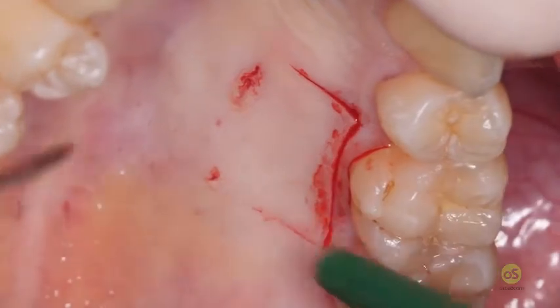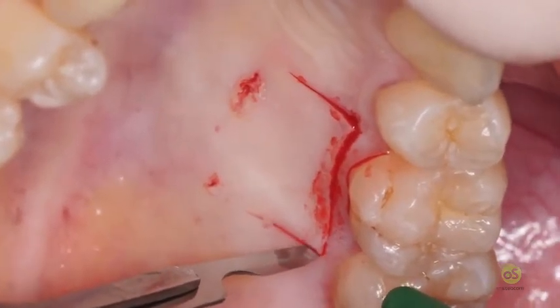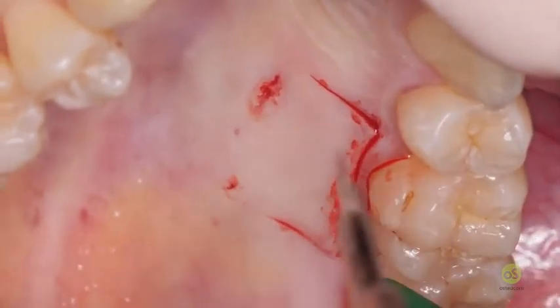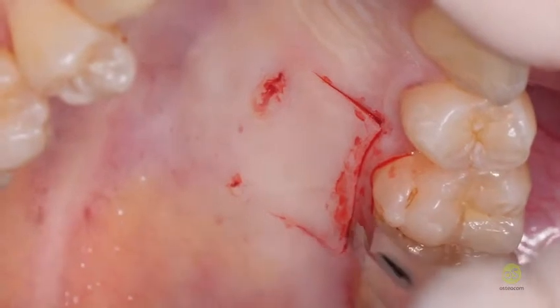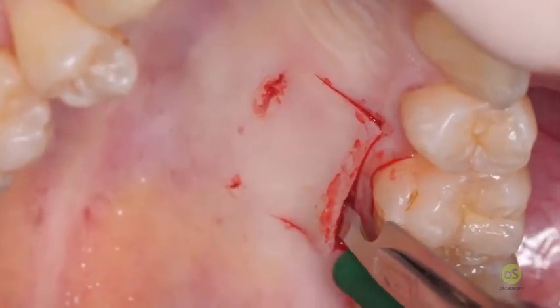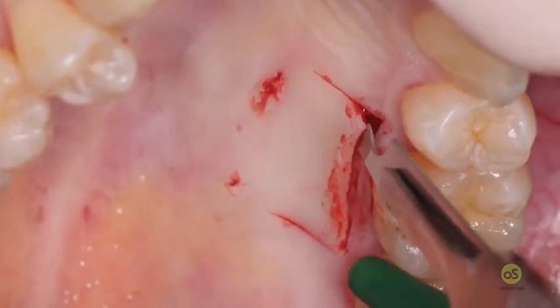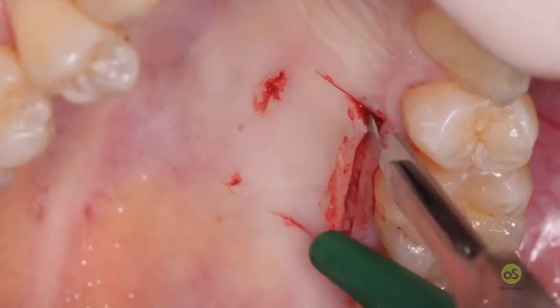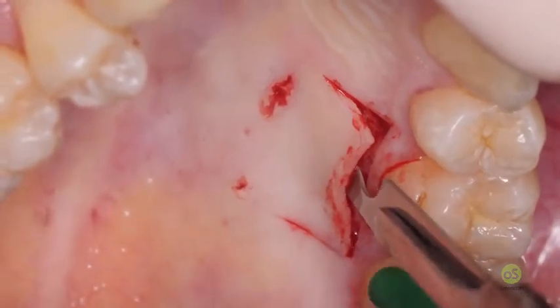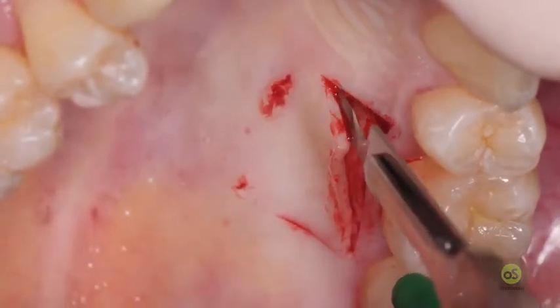Now it's time to open the distal vertical incision, rotating the blade, so the distal vertical incision is open like the mesial, distal, mesial and middle. Now it's time to keep the blade parallel to the soft tissue until the imaginary line connecting the most apical extension of both vertical incisions is reached.